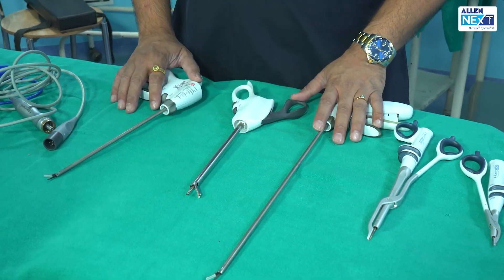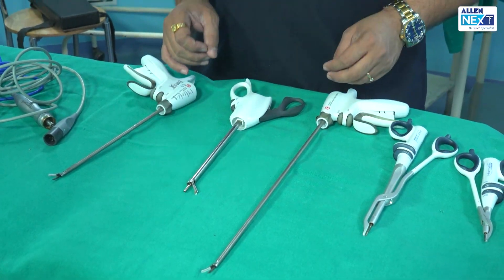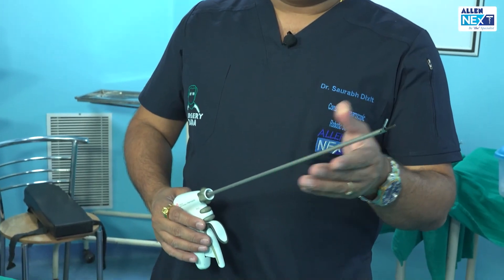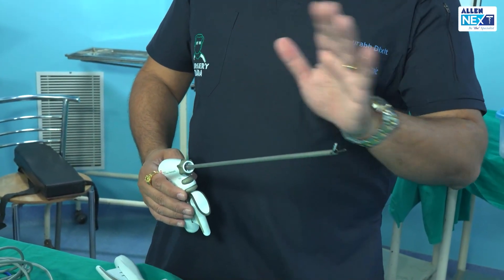Now I introduce you to the harmonics. When we talk about harmonics, what are they? They are new generation scalpels. When we talk about new generation scalpels, it is a great innovation. What is harmonic all about?